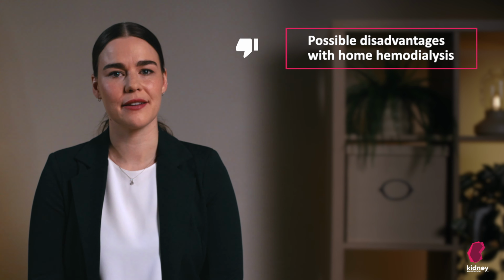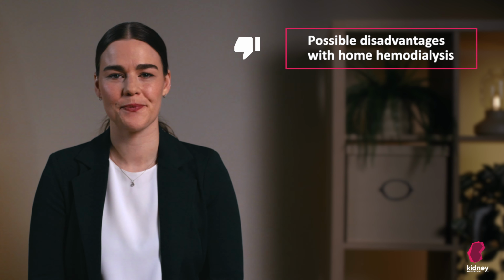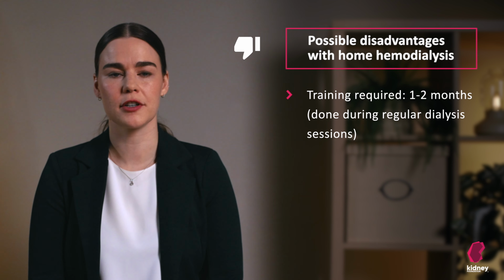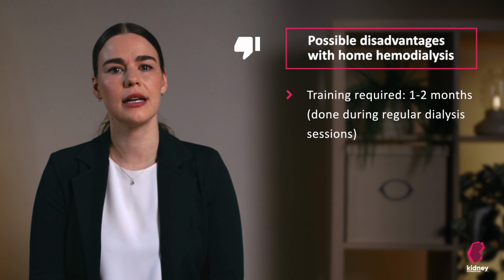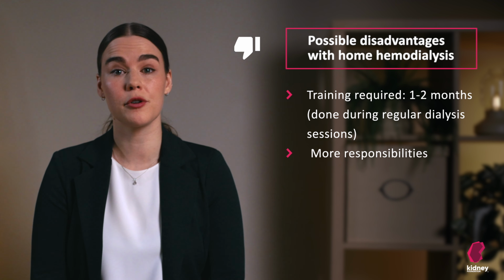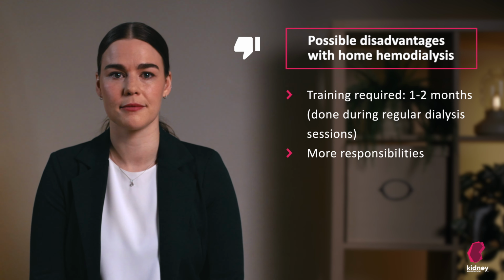Here are possible disadvantages with home hemodialysis. You need training. It takes about 1 to 2 months to feel comfortable and independent with the hemodialysis process. The training is done during dialysis sessions at the dialysis unit. You have more responsibilities with this type of dialysis.